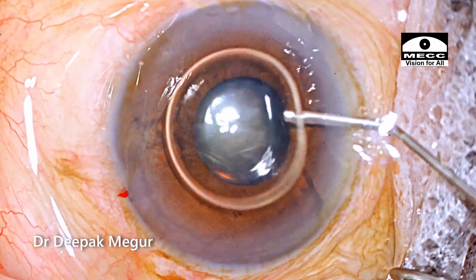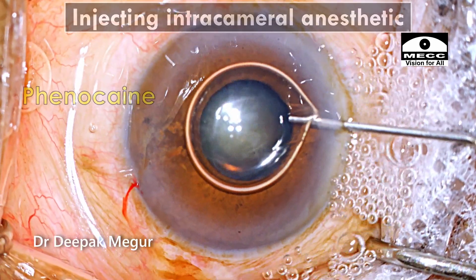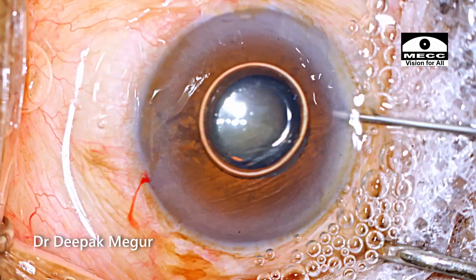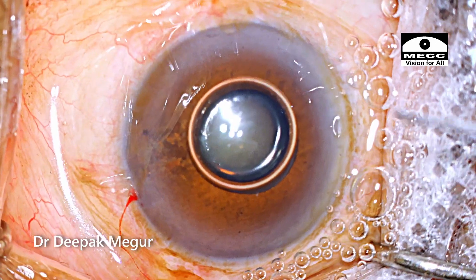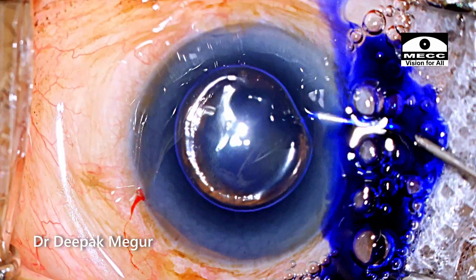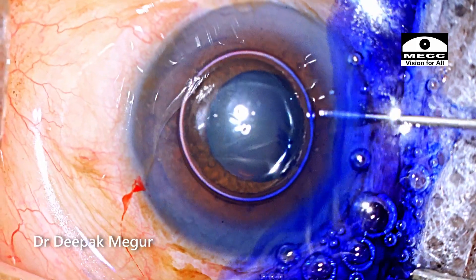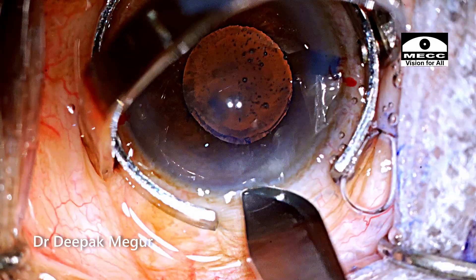After making the side ports, I'm using the intracameral dilating and anesthetic agent hoping that the pupil would dilate more. But unfortunately it doesn't. If the pupil is rigid, then it's unlikely that your intracameral dilating agent is going to help it in much way. After staining of the anterior capsule, dispersive OVD goes in first followed by cohesive OVD underneath it.